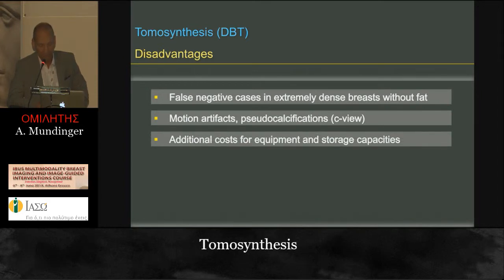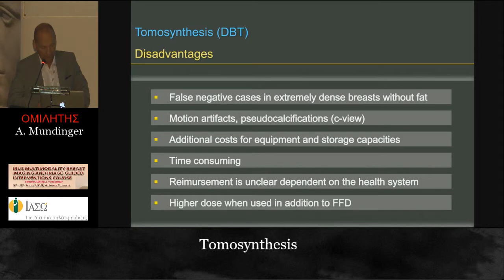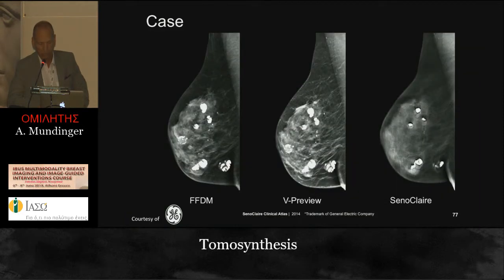And we have additional costs for equipment and storage capacities. It's time consuming. The reimbursement is unclear in several nations, and we need a little bit higher dose when comparing it with digital mammography.